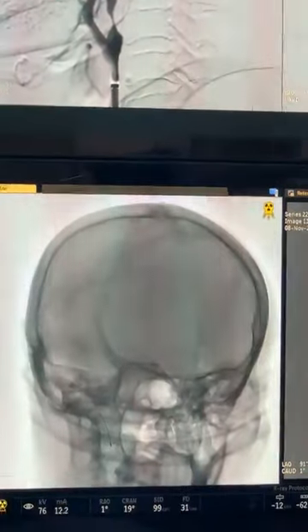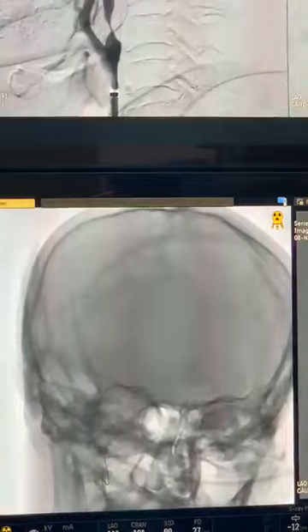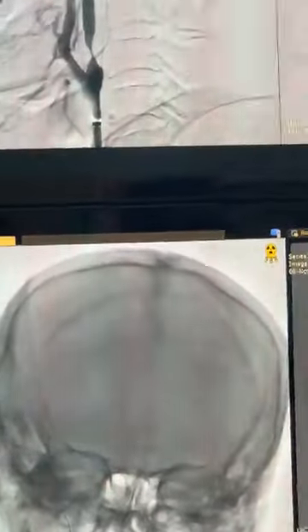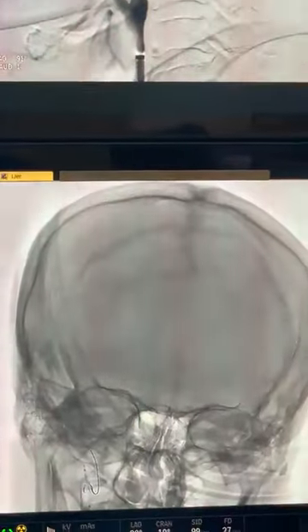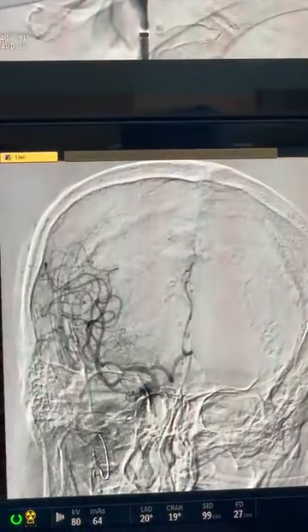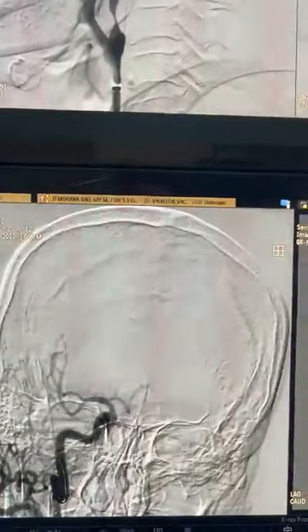What do you do for an acute ischemic stroke? You can do a thrombectomy. You can do a thromboaspiration. You can do a Solumbra. And what are the chances of new onset stroke, sir, post carotid artery stenting and angioplasty? With distal embolic protection, you don't get them. Less than 1%.